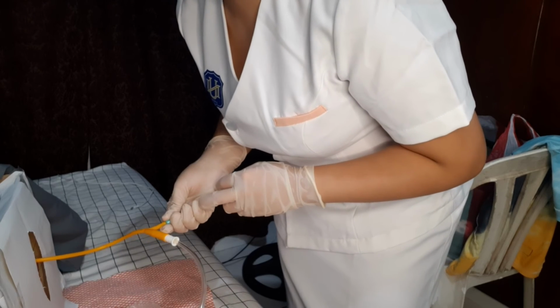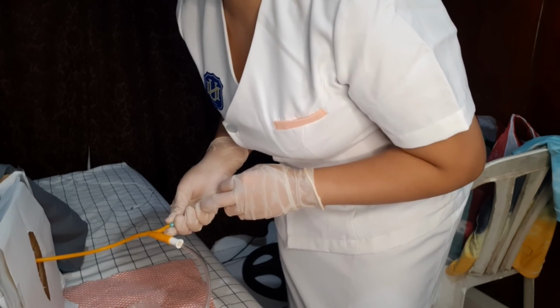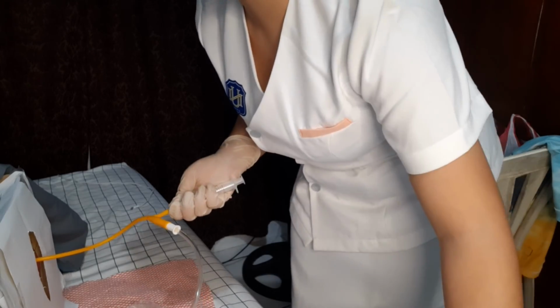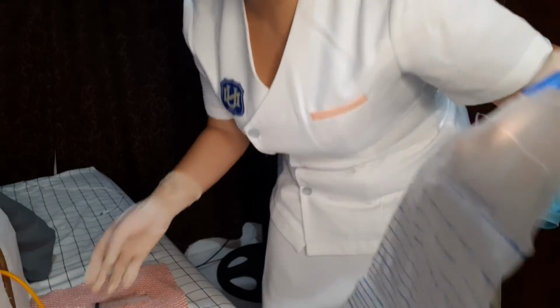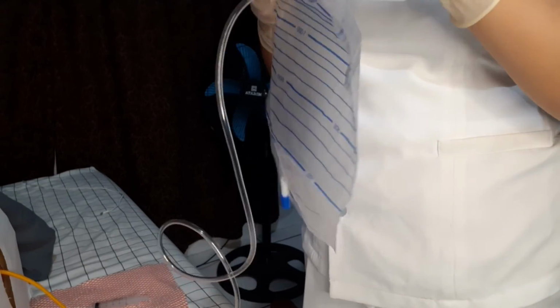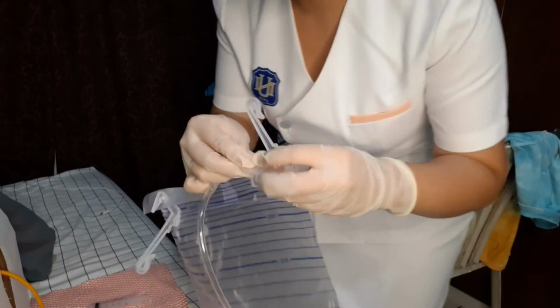Ano dito? Ibang konti. Sige. Parang naman dito. Dito. Ganyan po. Ganyan. Sige.